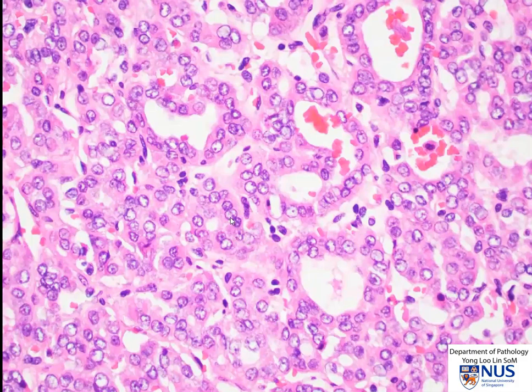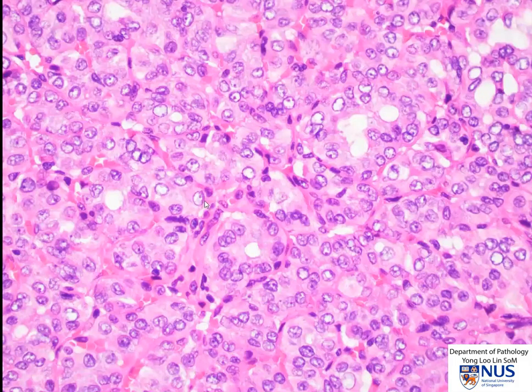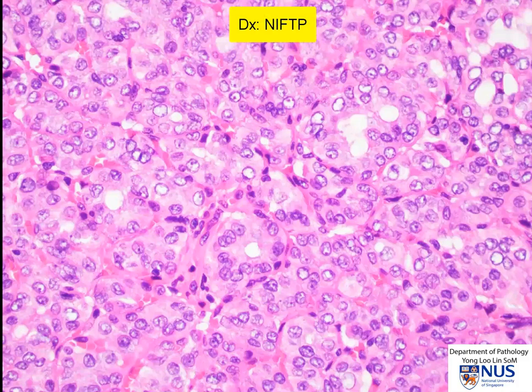Here is a higher magnification view to show the nuclear features that are very similar to papillary thyroid carcinoma. We have nuclear ovality, nuclear grooves, small nucleoli, and fine powdery chromatin. The final histologic diagnosis here is NIFT-P — a very well-circumscribed, partially encapsulated tumor with no evidence of invasion into the thyroid parenchyma, overwhelmingly follicular in architecture, exhibiting the nuclear features of papillary thyroid carcinoma.